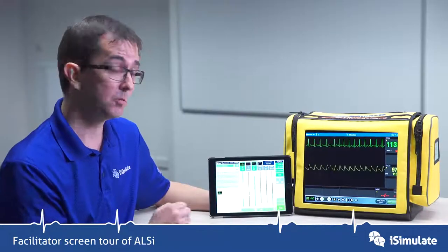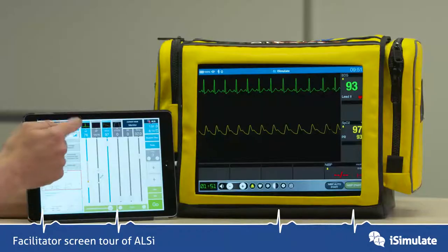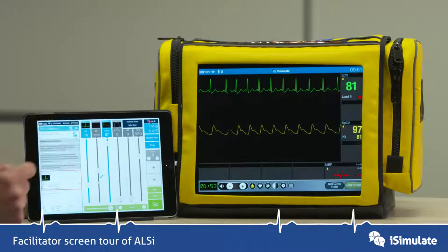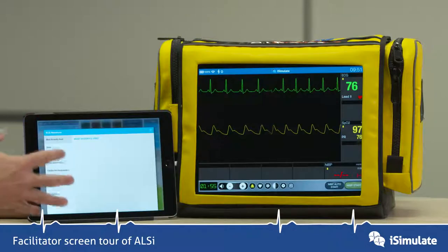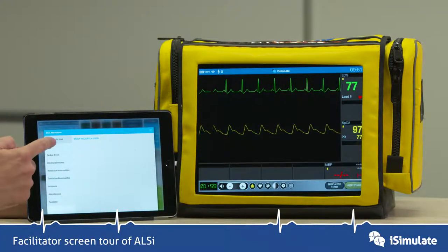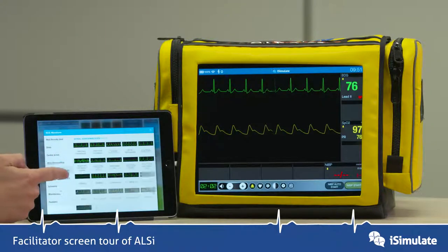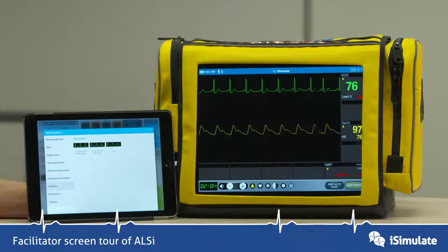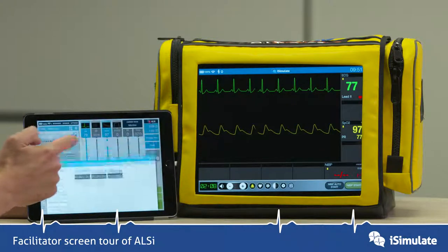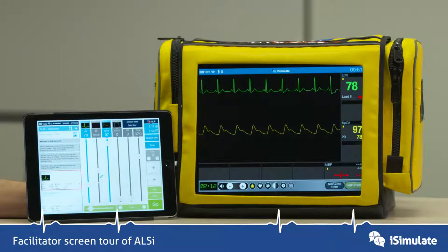What I can also do with the sliders is change what the waveform looks like on the screen — you do that by pressing the image button. When I press on the image, a menu appears of all different types of waveforms and you can see as I go through each of these there are many different types. I'm going to pick sinus with ST depression and when I do that I have to press go. Now you can see that the waveform has changed.